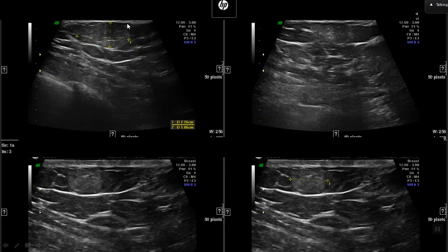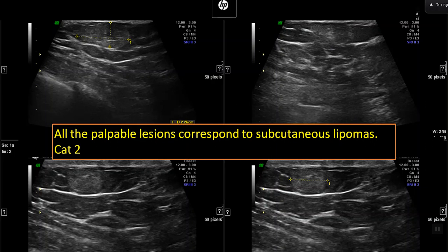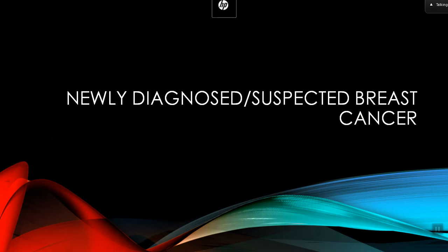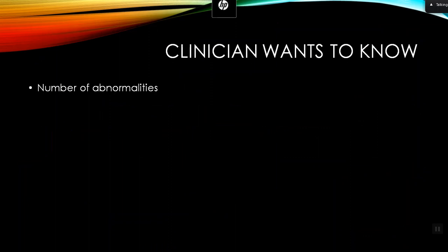A patient who has undergone mastectomy five years ago presents with multiple palpable lumps in the left breast. The mammogram appears relatively normal. On ultrasound, you can see multiple lipomas. If you just report this mammogram as normal, the lady is going to be extremely unhappy — she has come with palpable lumps and is a treated cancer patient. You must address each and every lump. All palpable lesions correspond to subcutaneous lipomas — state that clearly in your report.